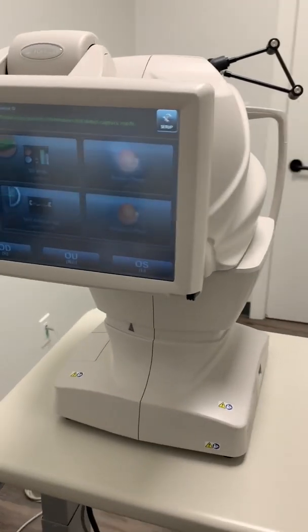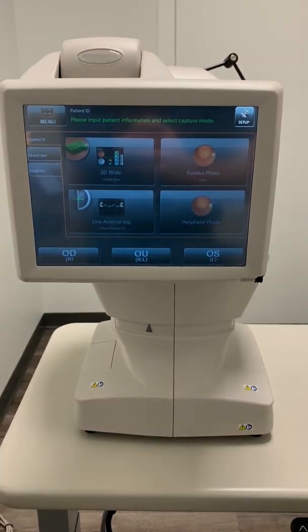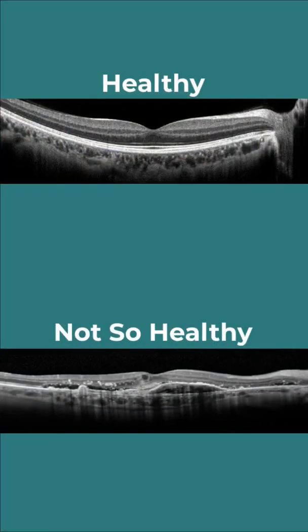The next piece is an OCT. In our clinic's case, our OCT and our retinal camera are two in one piece of machinery. With an OCT, it uses light to actually measure retinal thickness. Using those thicknesses, it has software that can put those together and give us a cross-sectional image of the retina. This helps us diagnose and manage eye diseases.